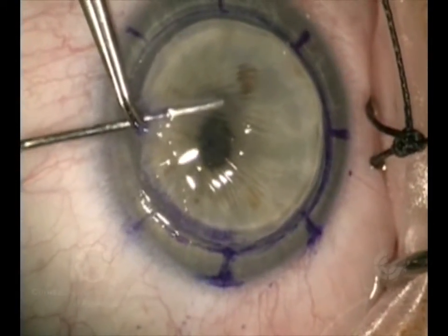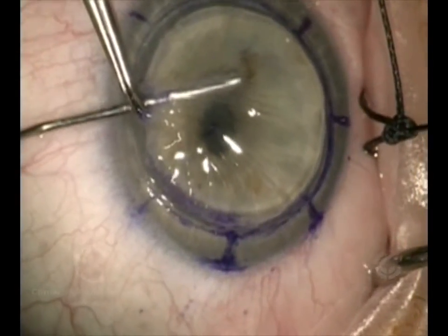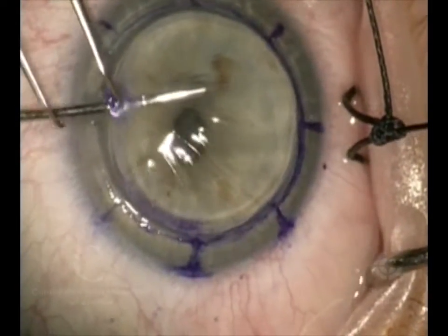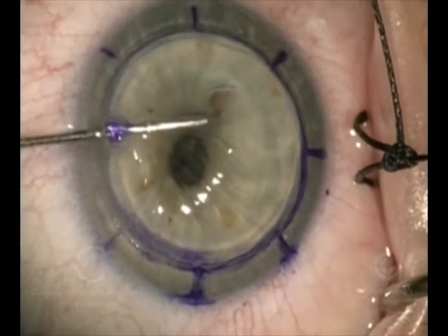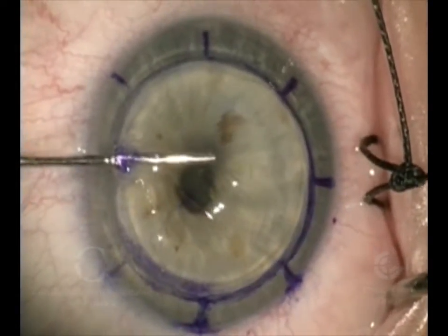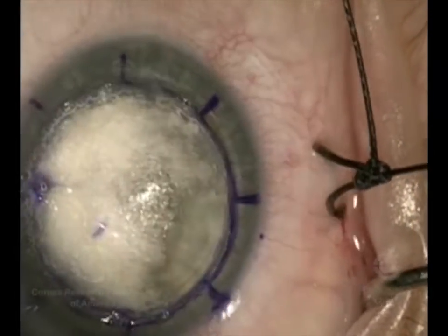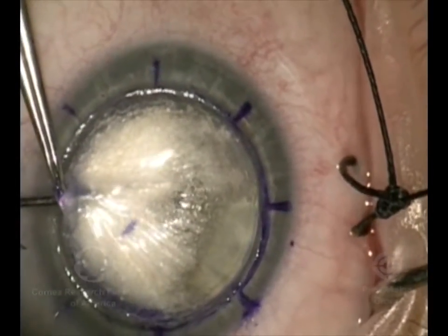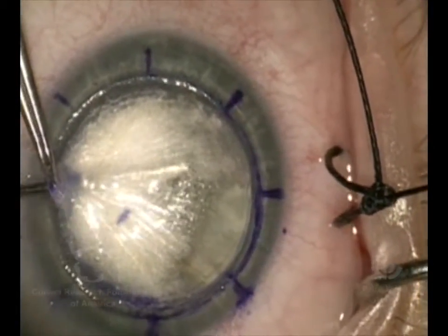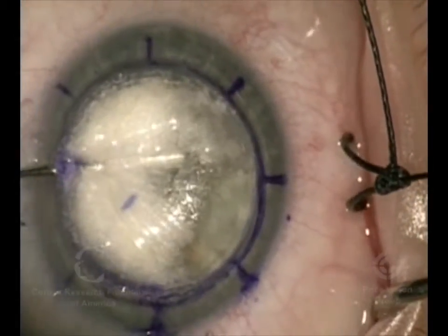Next we're going to inject air. When we do this, the cornea will turn white. The purpose of that is to expand the tissue so that the very back layer, which we call Descemet's membrane, will be separated from the rest of the cornea. We're going to inject another syringe full of air and put more air into the cornea.